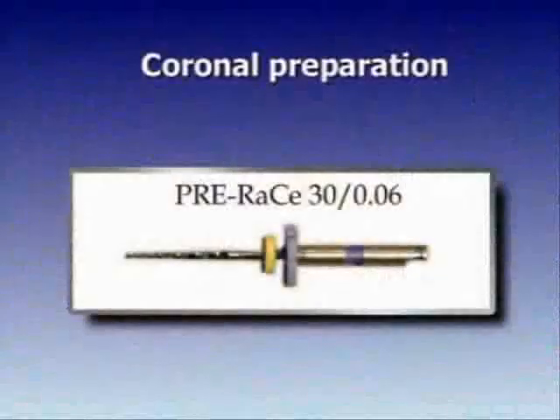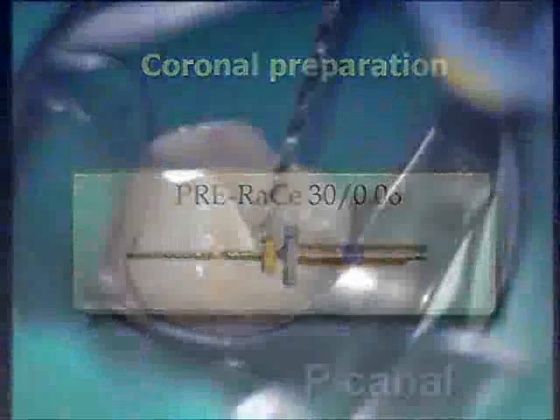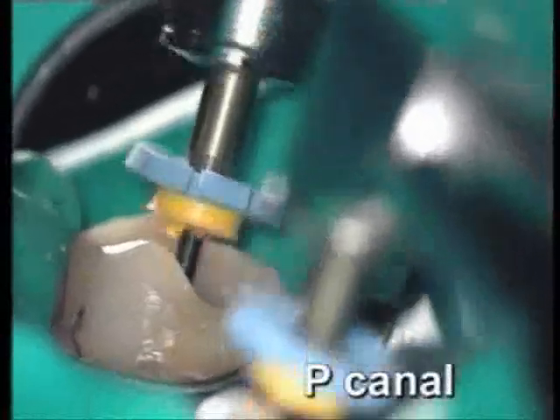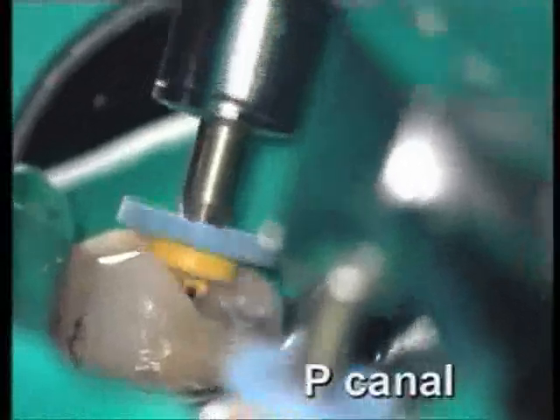We will now show the completion of the instrumentation of the palatal and one buccal canal. PRE-RaCe 30, 06 taper — palatal canal, three to four light strokes. Then the disto-buccal canal, the same.